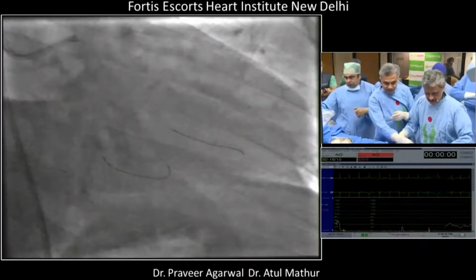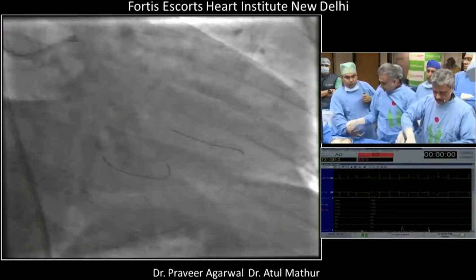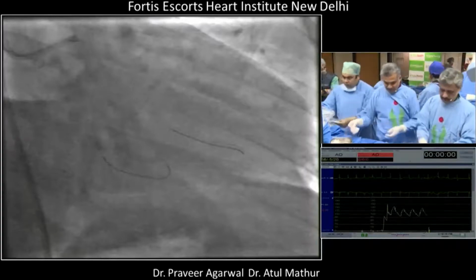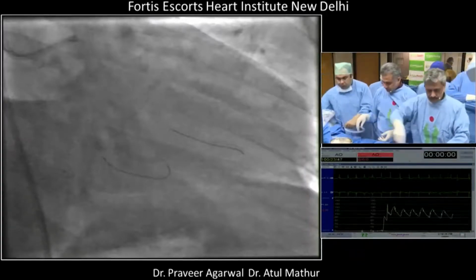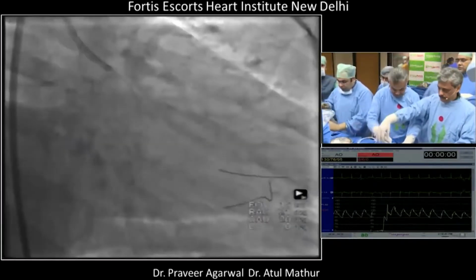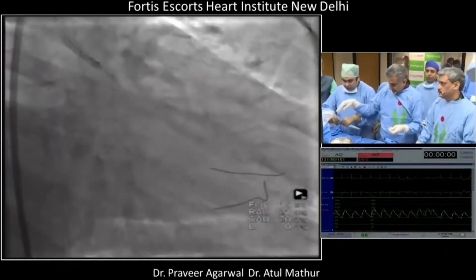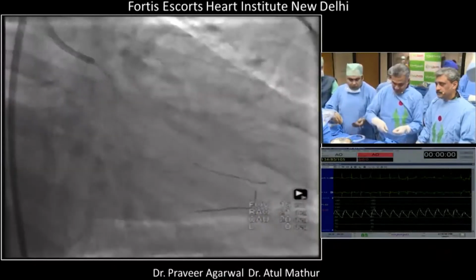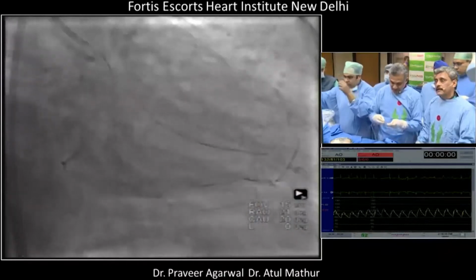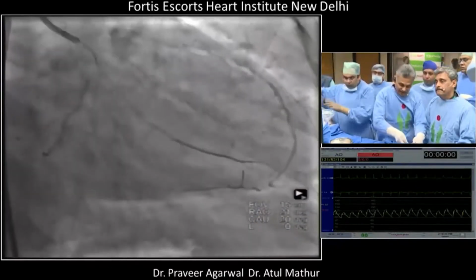Wait. Okay. No, it's holding the wires. Okay. Fine. But 2.5. See, 2.5, same Mosaic NC balloon. The OM branch, the angle is very narrow. Now we should do this first, otherwise nothing will go. Yes. He tried the second attempt, it's not the angle, it's a hard second OM. Even that angle, I think, couldn't advance. Is there no buddy wire there? No buddy wire?